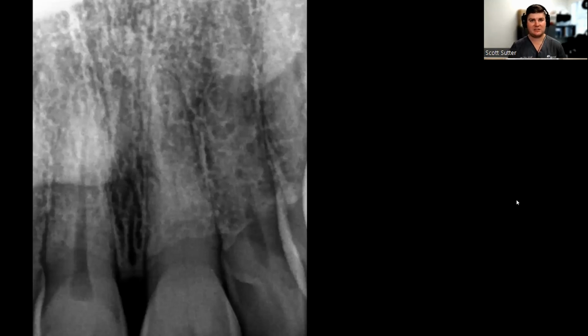So here's a case where her primary complaint was just the discoloration. Cone beam looked clean. And that's the other thing. On these cases, I highly, highly, highly recommend getting a cone beam on them, because while it looks clean, I don't know how good the projector is, but you can almost see a line running through there.